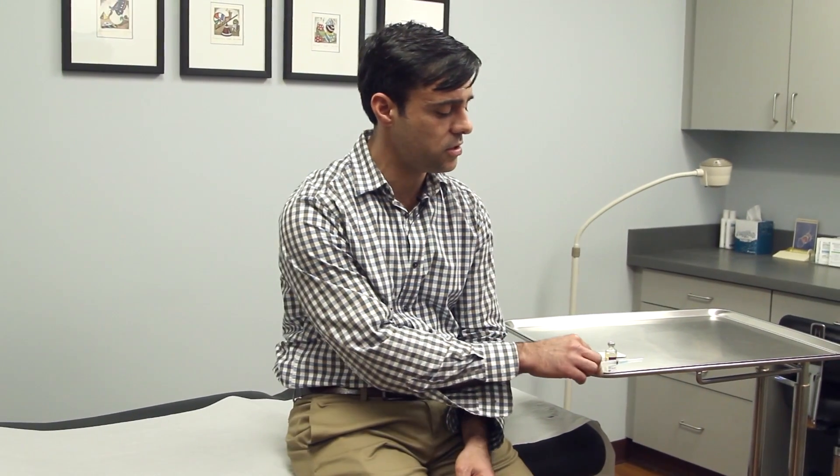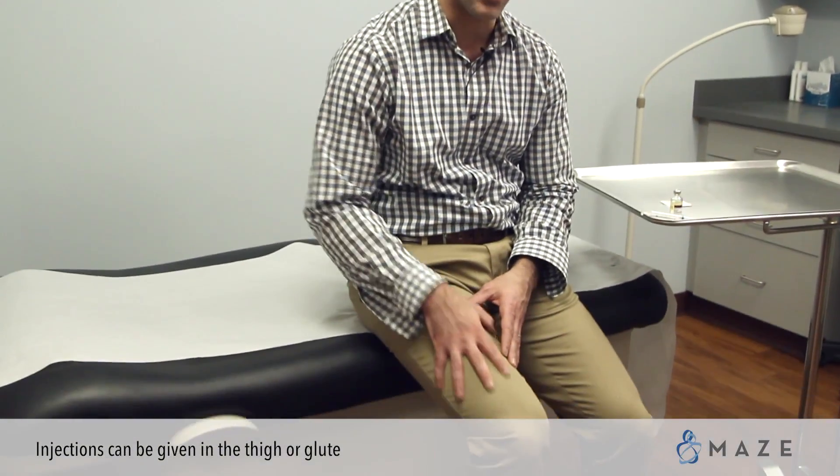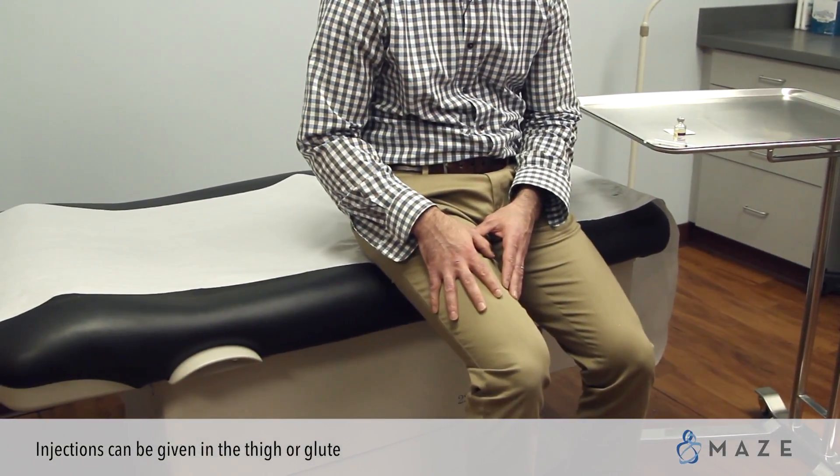You will draw up your dosage as you have been instructed in previous videos. The two places that you will do an intramuscular injection are the thigh and the glute or the butt.